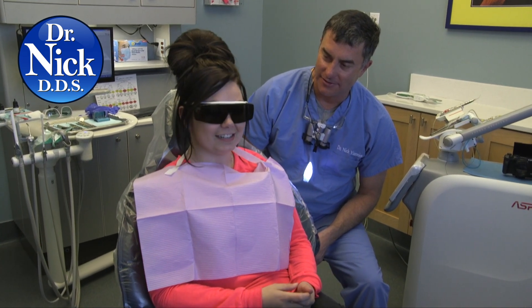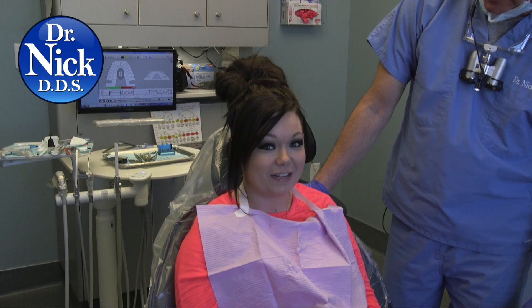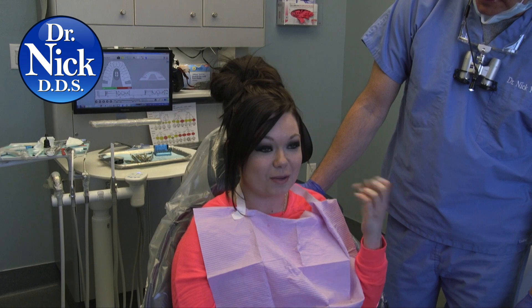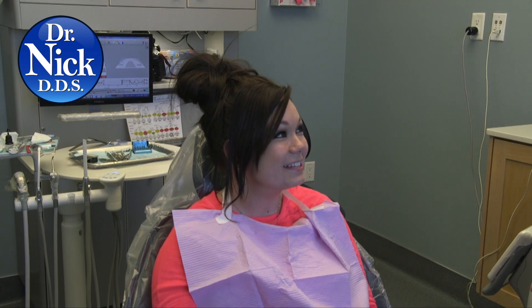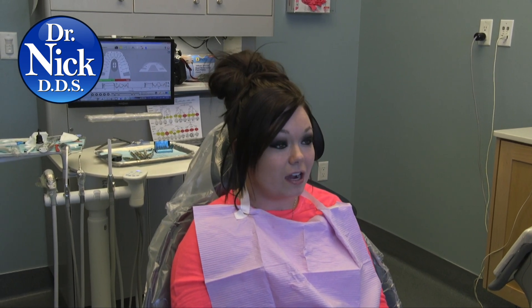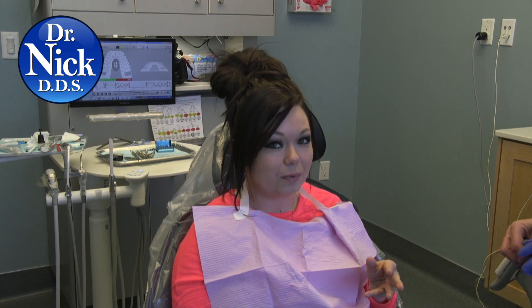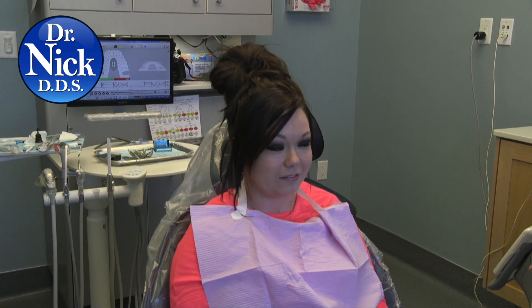No one likes the drill either — the noise, the vibrating. I didn't feel anything. All you hear is the popping, but as far as tooth sensitivity, it's like I just had my mouth open for 20 minutes for nothing. It was no big deal. Did you feel the filling, the water, any of that? No. There was one point with a little sensation of cold, but it didn't last long at all.